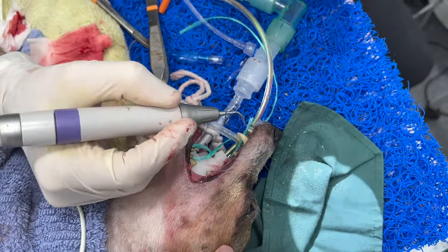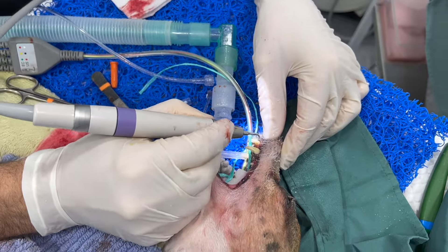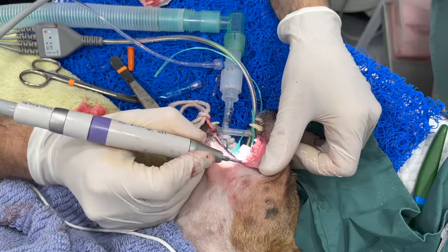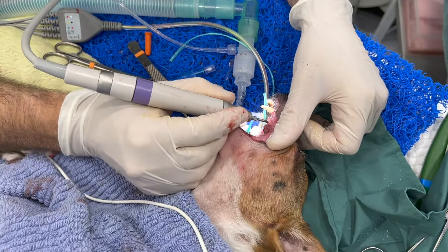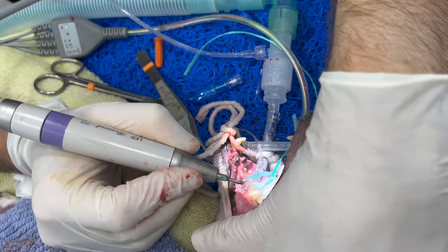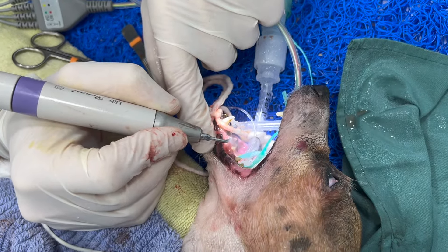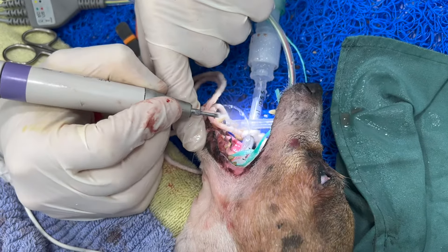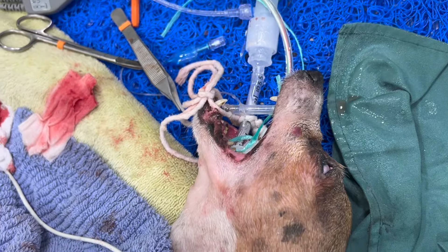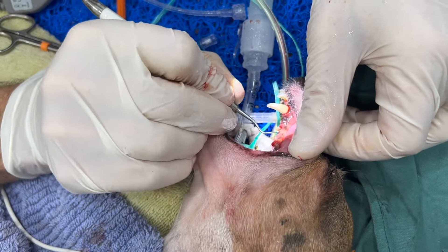It's a bit like painting a masterpiece — you can take as long as you like, but I've got a limited time. We've been under about half an hour and still have the other side to do. It's generally better to do two one-hour dentals rather than one two-hour dental for safety. The next step is sub-gingival curettage — going just under the gum and cleaning out under the gums.